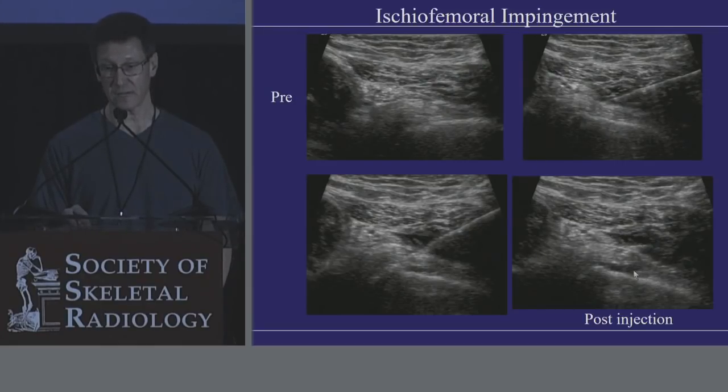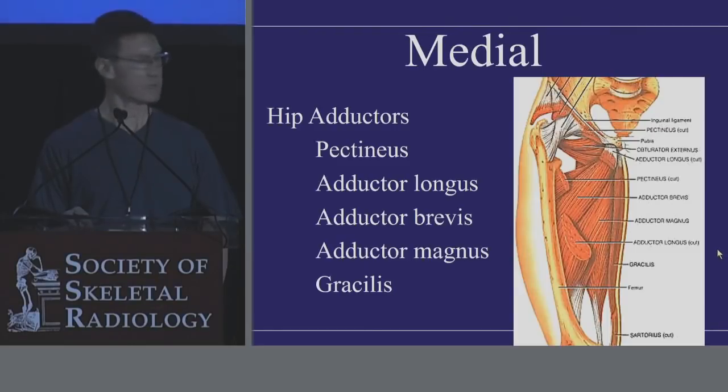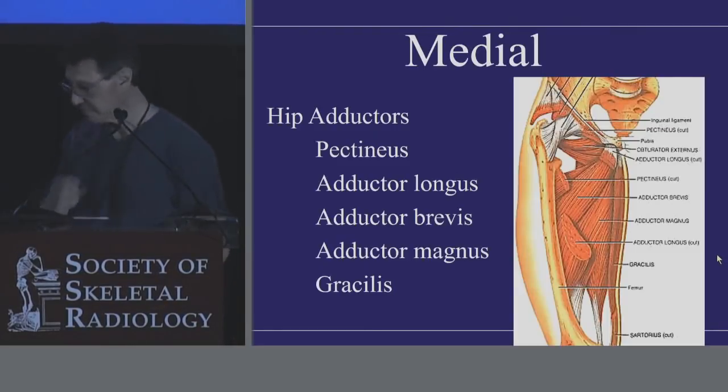This is lidocaine and Marcaine, compared to what it looked like before I stuck my needle in it. And this patient happened to get relief. Okay, John? All right, thanks, Ted.